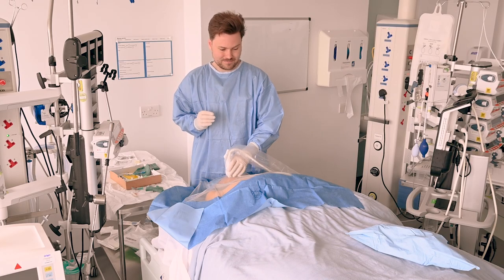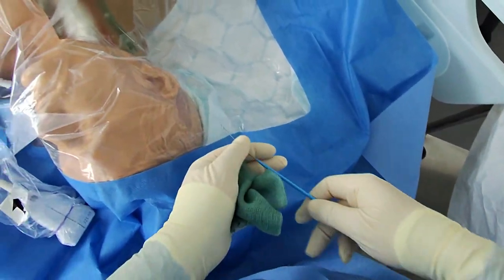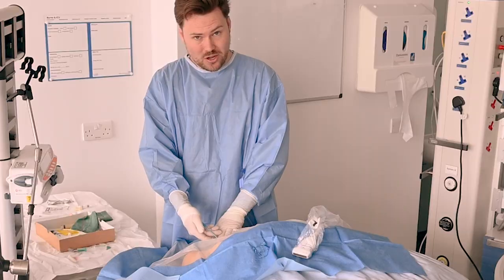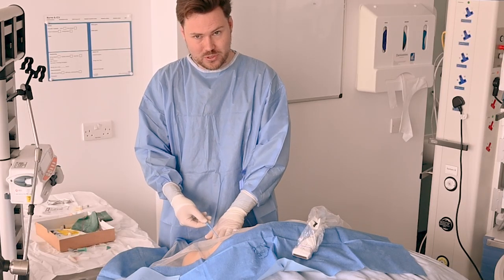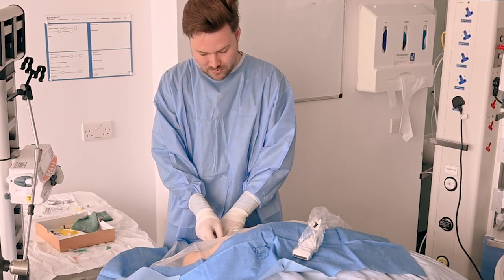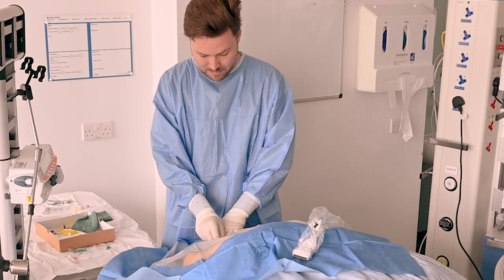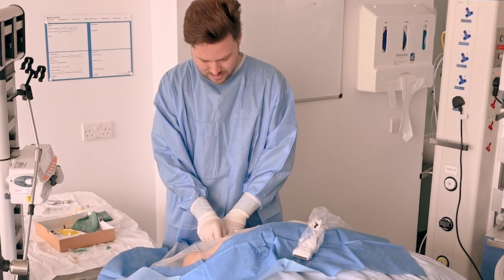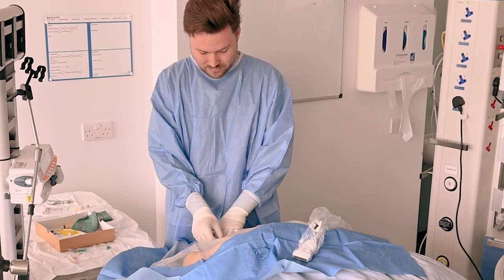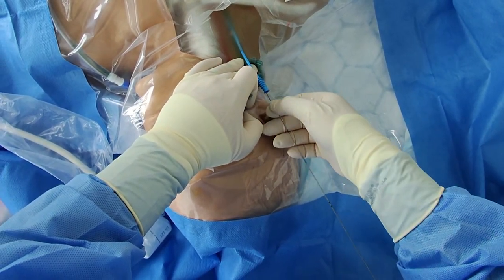Now we can move on to dilating. Load your dilator onto the guide wire. I'm going to be putting some traction upwards on the patient's skin. The key is to hold the dilator down near the tip, not at the hub — you don't want it to bend and kink the guide wire. Push smoothly and rotate if you feel a bit of pressure. This shouldn't be too difficult, but it's often the hardest bit of the procedure, particularly for patients if they're awake. You'll feel a slight give as the dilator enters the vein. After that point, rotate your dilator to make sure that any tissue that you brought with you is not going to close back up as you take the dilator out.